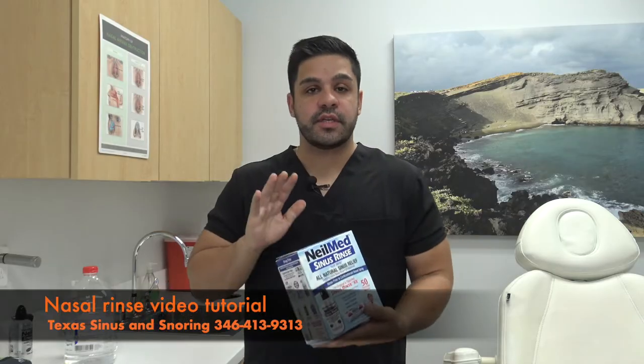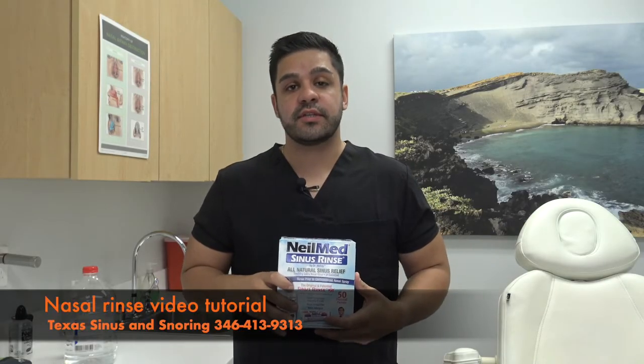My name is William and under the direction of Dr. Benjamin Cilento, I want to go over with you today how to properly use the Neomed Squeeze Bottle. The Neomed Squeeze Bottle is a great tool for universal nasal health, especially after a procedure with Dr. Cilento. This will be a crucial part of your recovery and it's a must to know how to use it, so let's get started.